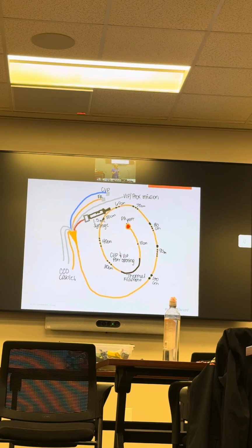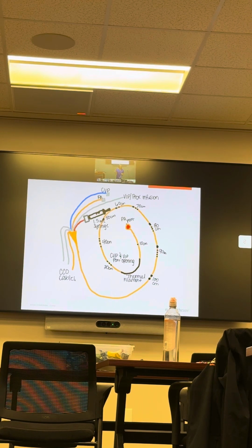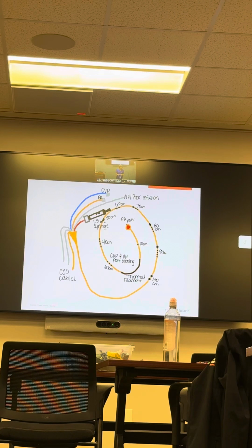So, you'll also notice on this red lumen, there is a locking mechanism. There is a way to move this little piece here, which will lock this lumen. And I know that some of you have been taught to keep it locked. But let me tell you what happens if you teach an entire group of nurses, an entire group of clinicians to keep it locked. Someone inevitably will forget or not even know how this works, okay? And if you teach them to keep it locked and they come in and see, oh no, it's not locked and I'm supposed to keep it locked, they will just go ahead and lock it.